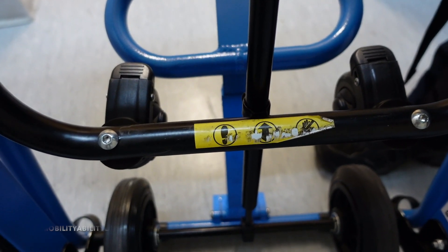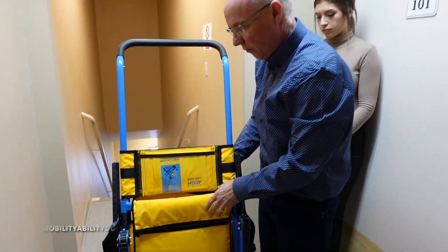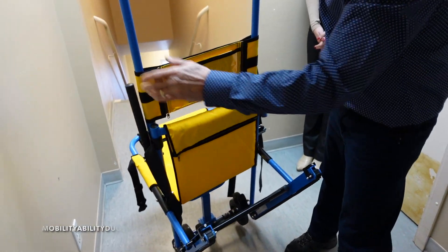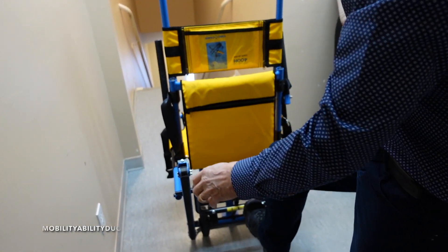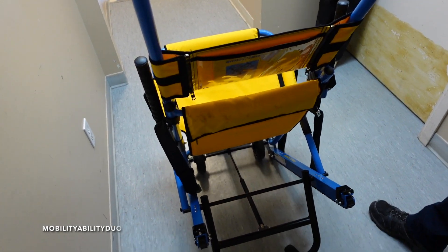There's a little diagram there too showing what to do. That little clip clips in - that's just for folding. For unfolding, you just open it up, unclipping the clip, and there you go. So you've got it on the wheels.